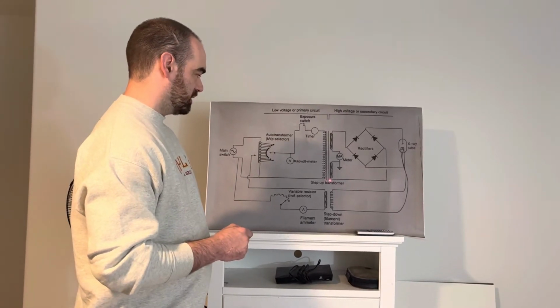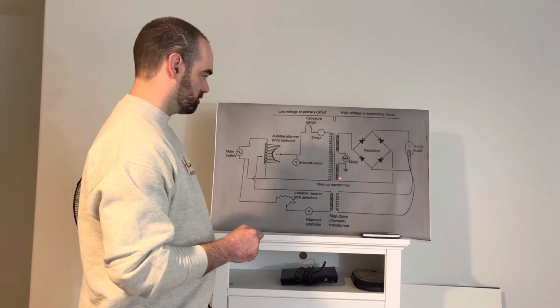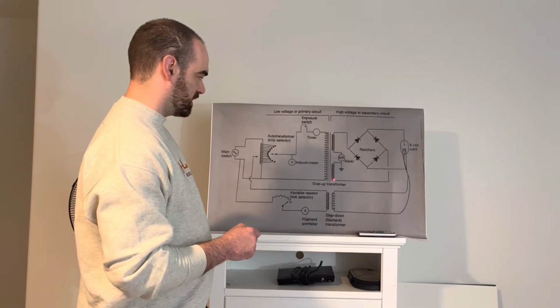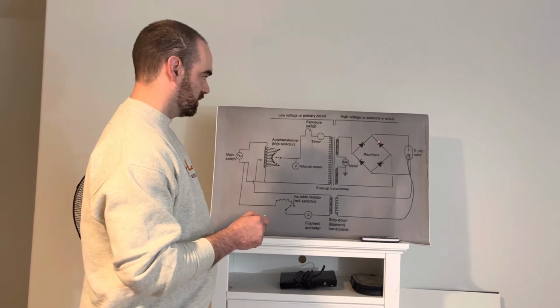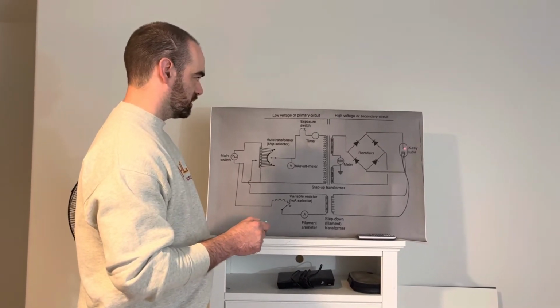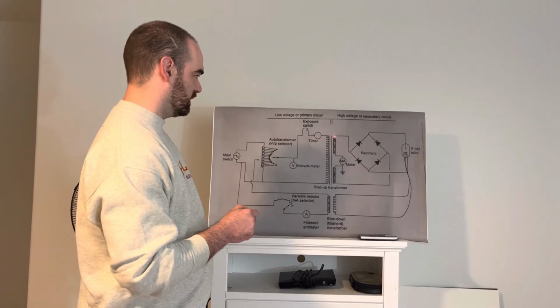The second path, after the first path and back and forth, will start here, go through this diode, then through the X-ray tube, then the second diode here, and end here.